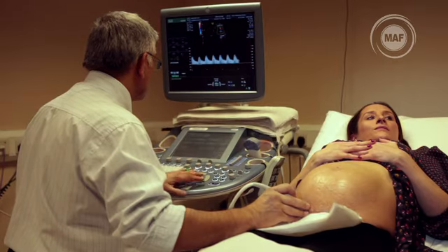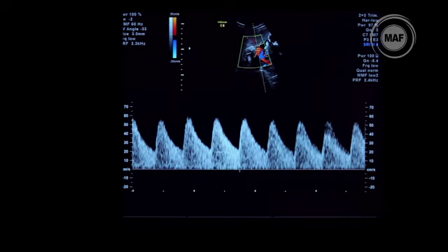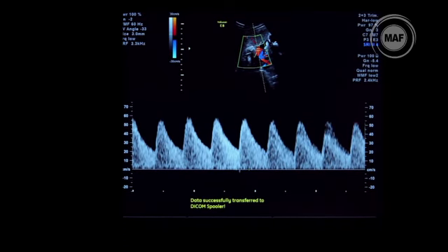And that's considered a good trace because, as you can see, it's steady, it's bright all the way through, there are no dropouts, and all the peaks are even. Okay, you can do umbilical artery auto trace, it automatically traces it, or you can do a manual trace.